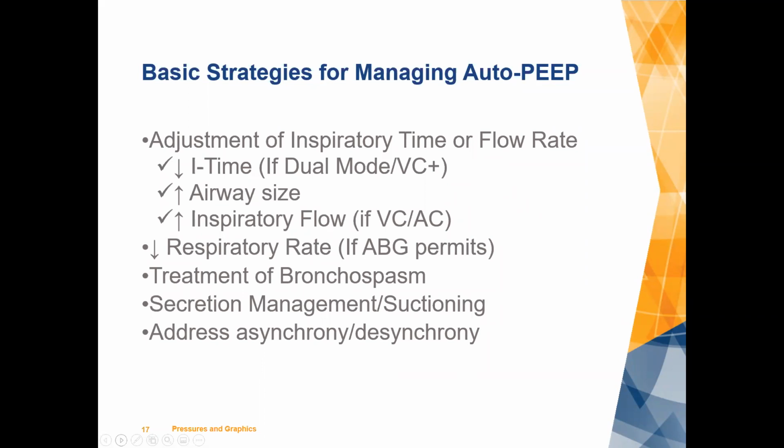But when you first get the patient, in order to manage them, in order to see where you are setting-wise, in order to help minimize the chance of a tube dislodgement, just overall patient management, they really should be sedated. If the patient continues along those lines, and they're getting really poor ABGs in addition to the asynchrony, and they're really, really sick, maybe they have septic shock, maybe they have ARDS, a lot of those patients end up being chemically paralyzed so that we can actually manage them. You take asynchrony out of the issue, and many times in doing so, you're going to take the auto-PEEP, if they have it, out of the equation too.